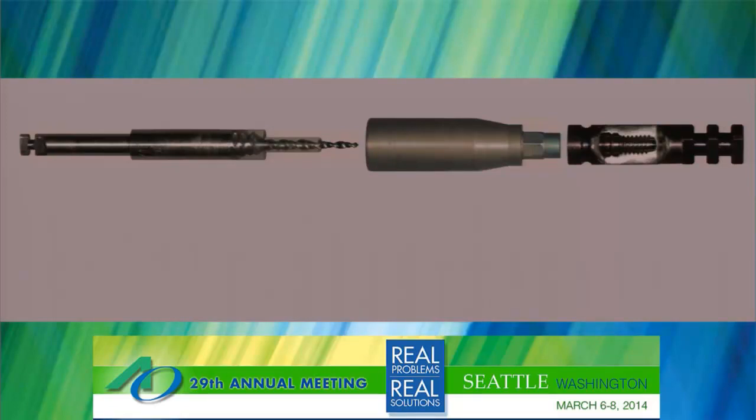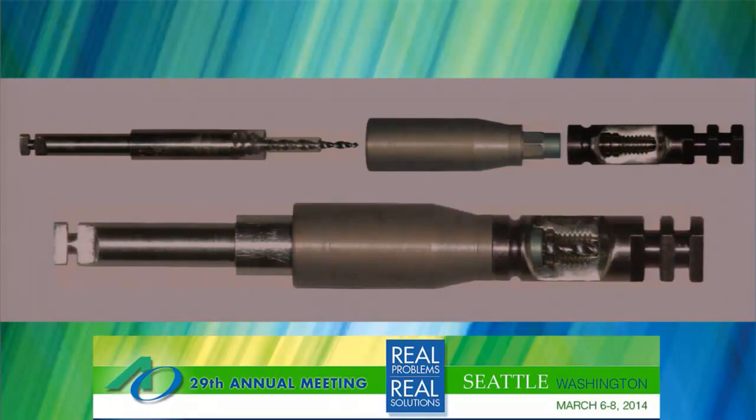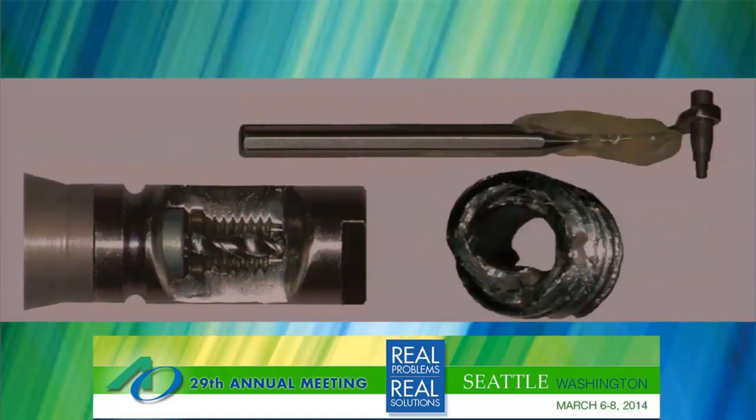I looked under the microscope, and the guide against the recovery tool, their particular version of a fragment fork, had so much wobble in it that I could touch the threads on this opened up analog if I got it down into the implant. So I just totally rejected their option, and I made my own guide, and happened to have a little machine shop. So made the guide, and this is a drill. This is a $4 drill that I modified. But when you assemble it all, you have a screw that's very, very precision into the internal aspects of the implant. And this is the kind of control you need to be able to effectively work that.